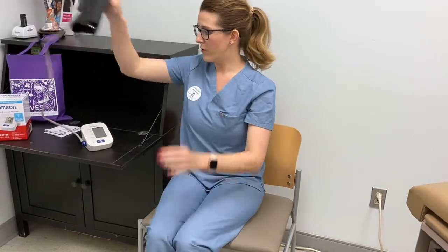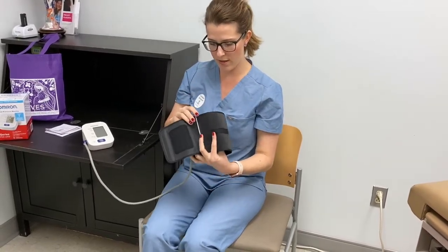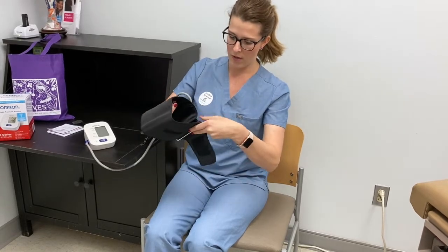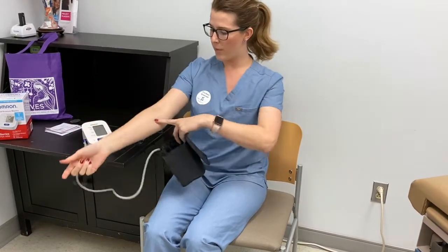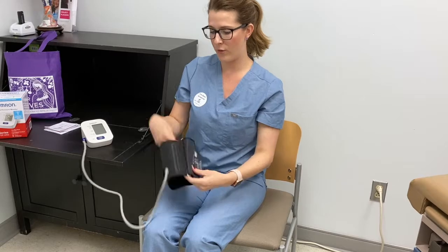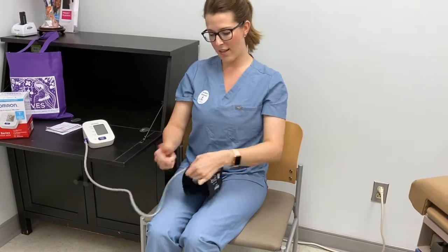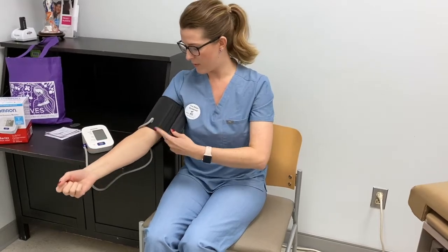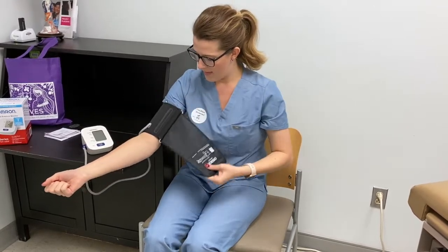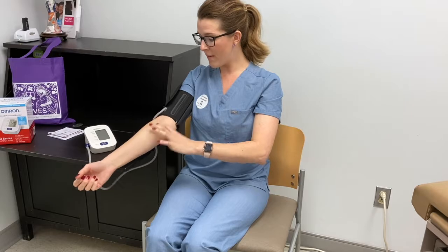So what you'll do is you'll take your cuff. This one's really nice because it's easy to do with one person, and you'll put it on your arm. What you'll do is you'll try to line this up with the center of the inside of your arm. So if you can imagine your veins running right here, sometimes you can see one in your crook. You want to line this up with that vein. So slide it up to your upper arm. Then you can tighten by just pulling the strap. And you can see here how this isn't perfectly lined up with my vein. That's okay. I just want it to be showing on this side of your arm.